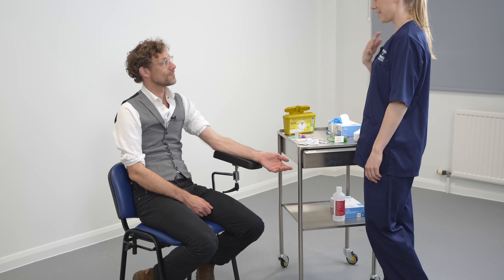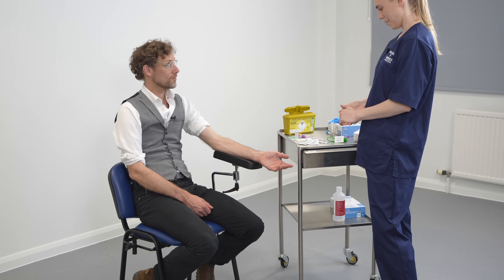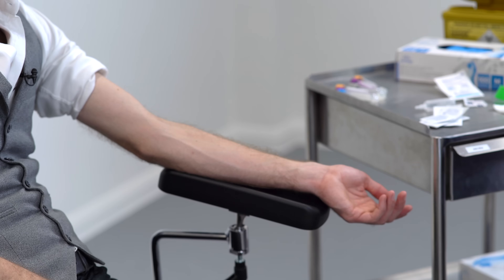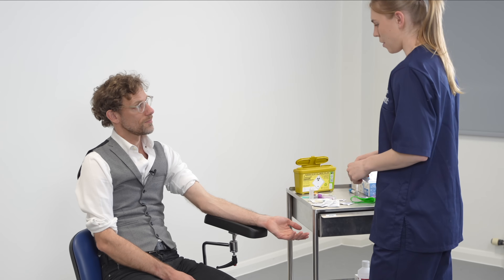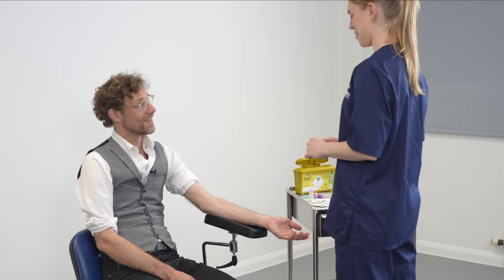Hello, my name is Megan, I'm a medical student. Before we begin, can I confirm your name and date of birth please? James Gill, 25th of 6, 84. Thank you. And are you on any anticoagulation at the moment? I'm not. I can see from your arm that there aren't any signs of infection or any cuts. I like to have a look at the arm and see if there are any good blood vessels poking out. You seem to have quite good blood vessels to take blood from.